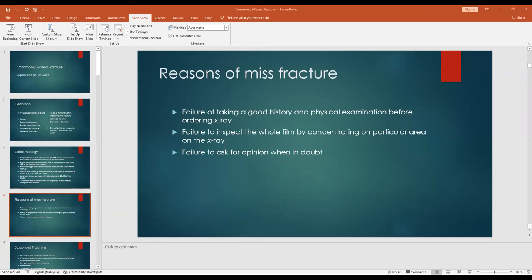Hi, I'm going to be talking to you. My slides are actually very simple, and my information is also very simple, because we have not seen COVID for a long time and have forgotten about it. My topic is lines and signs of fracture on X-ray in the upper limb. Why do I only cover the upper limb? Because there are too many things to cover and my time is limited, so I am only able to cover the upper limb. Sorry about that.